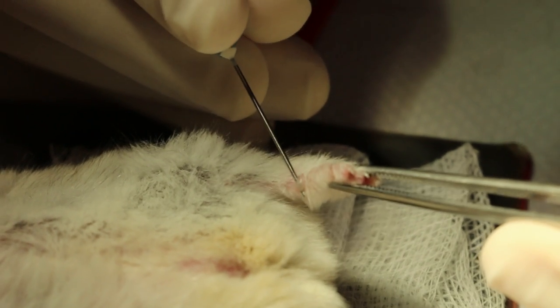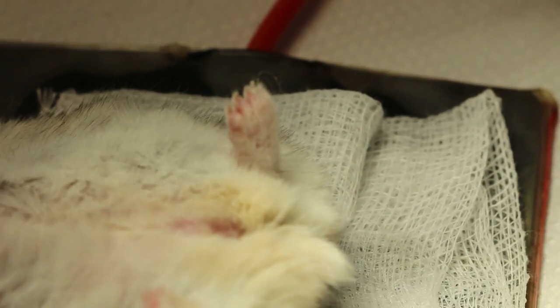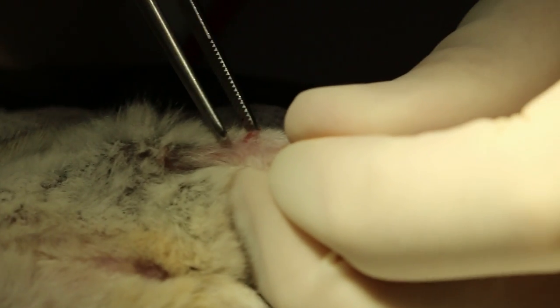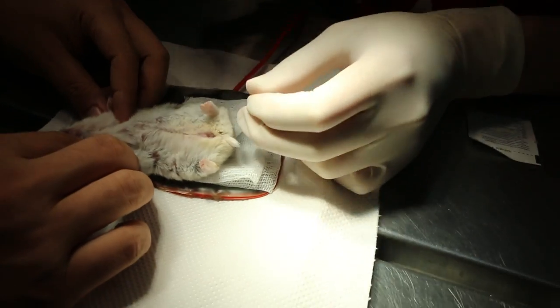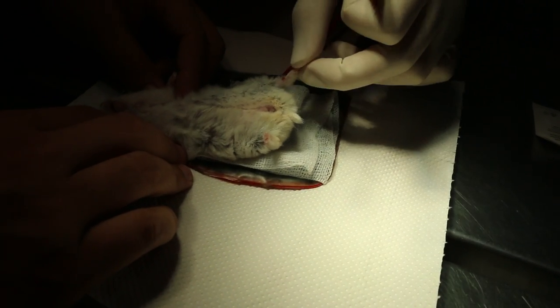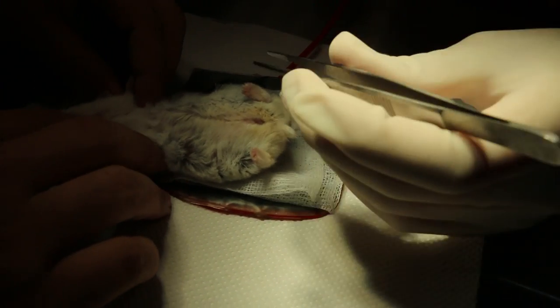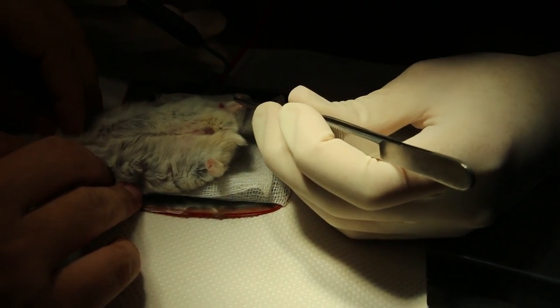53 grams, about 1 year old. Any pus come up? Drain the pus. Okay, then the other side, the wound, stitch up. You take out, is it? No, the other one, the wound, need to stitch up. Is there a wart? I take out this one as well. Don't touch your table.